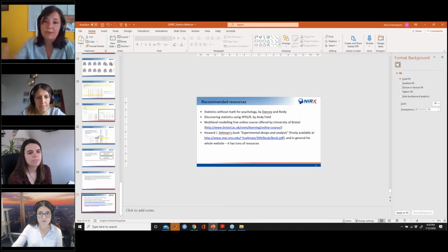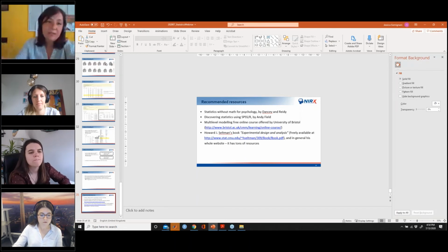As for the length, the covariate needs to be as long as the time series. If it is longer because you measured it concurrently, but maybe one started a little earlier and one finished a little later, then you can trim in order to achieve the same length. The important thing is that they are actually concurrent.